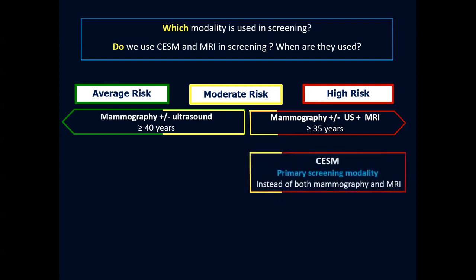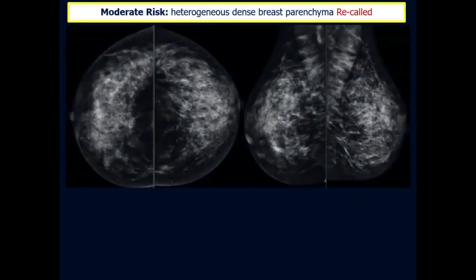And it is here exactly where contrast mammography can compete, because why perform mammography alone and MRI alone when we can get the same information using a single modality, which is contrast mammography? But up till now, there is no sufficient evidence in the literature that contrast mammography can totally replace MRI, and it is used on recalling patients from screening programs and in the follow-up of some selected patients.